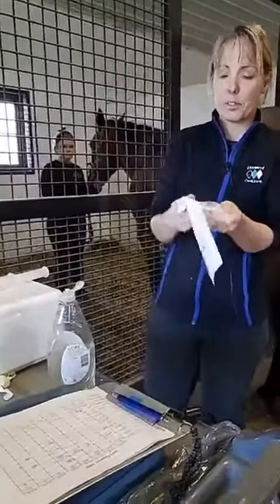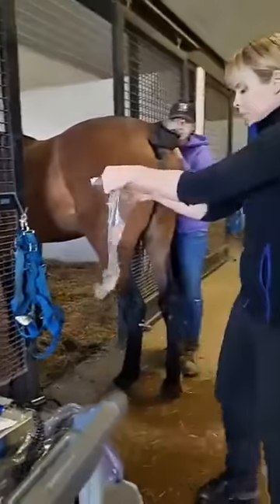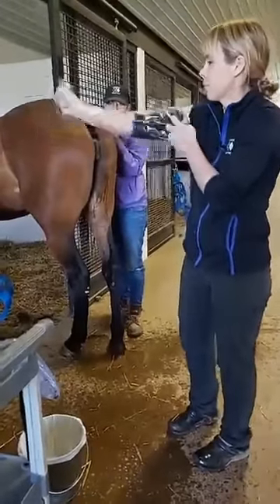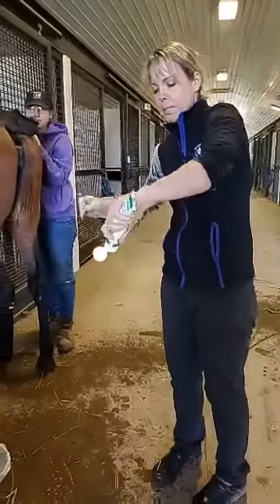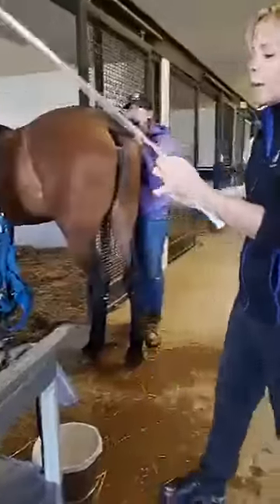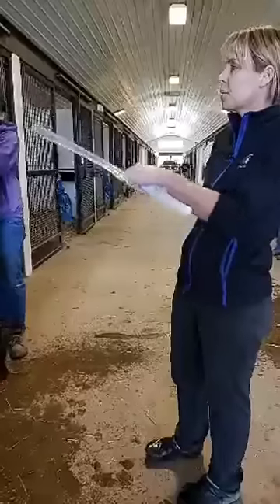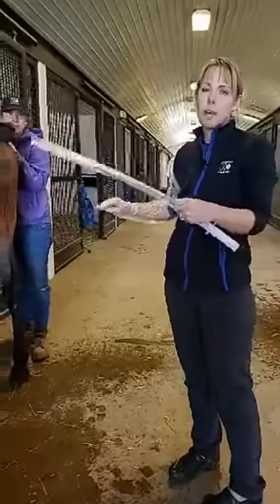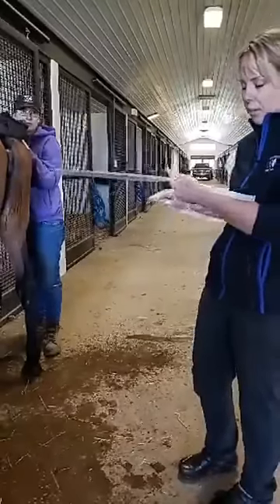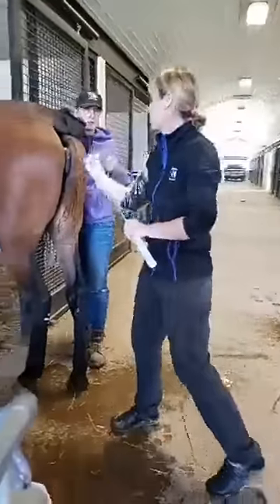Now I'm going to open up a sterile sleeve — I don't want it to touch anything — and then I'll take my sterile lube, drop a piece out onto the ground first, and put a little lube on my hand. I grab the syringe. My last checkpoint: all of our mares here at Diamond Creek have numbers associated with their name, so the last thing I'm going to do is double check that her number on her halter tag matches the mare. Father Patrick, Piranha Fury, number 51 — and Abby at the front confirms 51 is the correct tag number. Here we go.